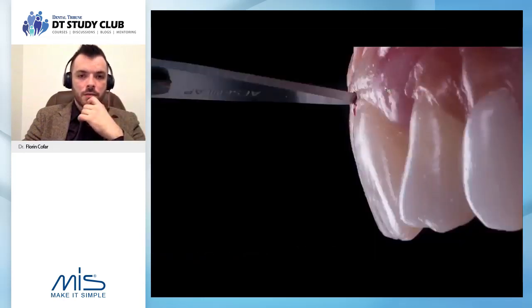So again, as a workflow, we will always start with a design, as you can see here. We will render to the patient what we're trying to get. And this is a case that we actually did the surgery 2 weeks ago. So it's not yet, actually the implant is not yet integrated, but it's nice to explain the entire process.